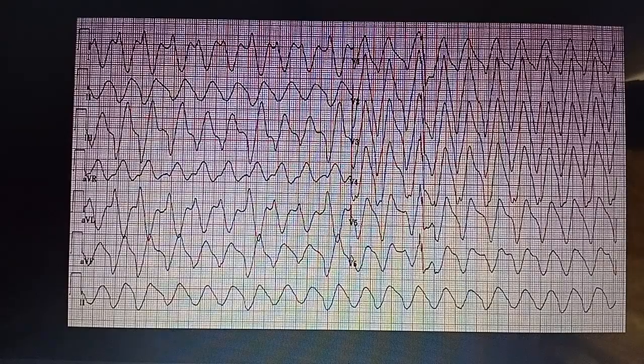If the potassium keeps on increasing, there is widening of the QRS complex, which then merges with the T wave, and there is the characteristic sinusoidal pattern, which signifies severe hyperkalemia, and it can eventually lead towards ventricular fibrillation.